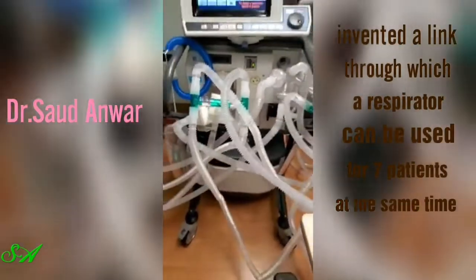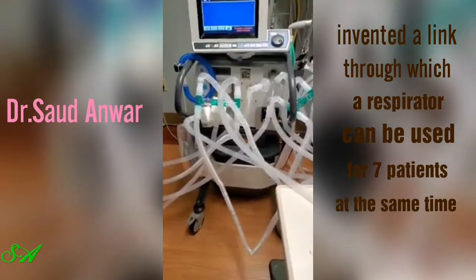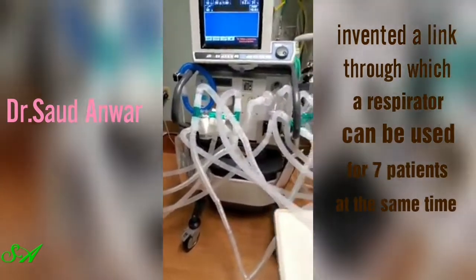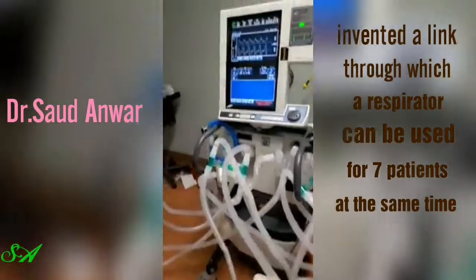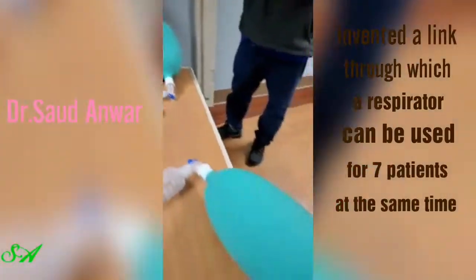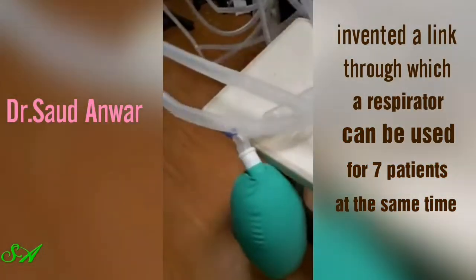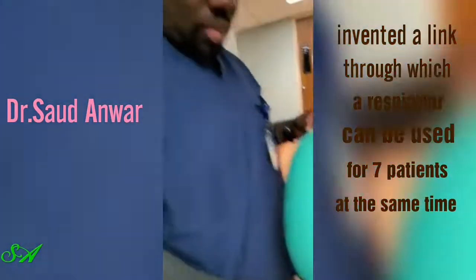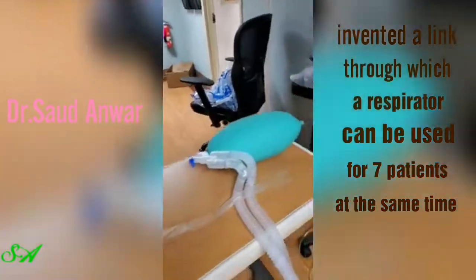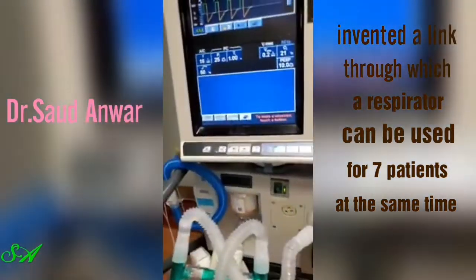So when you step back, you see all of these different tubes, which are truly confusing, but actually there's a method to this madness. And that method is allowing us to currently ventilate 1, 2, 3, 4, 5, 6, and 7 patients. And we could potentially get another one and more if we needed to.